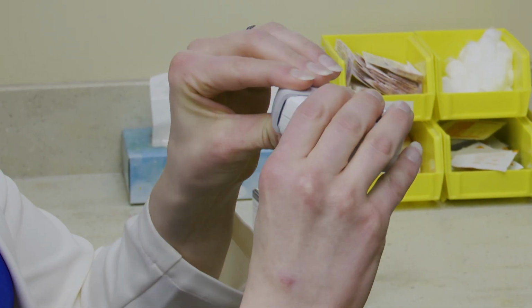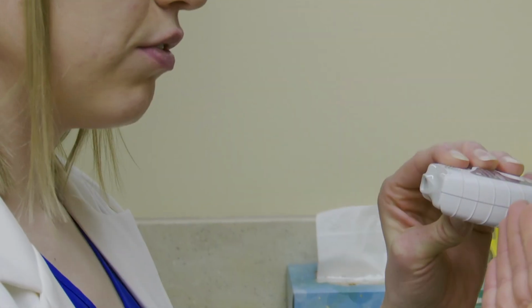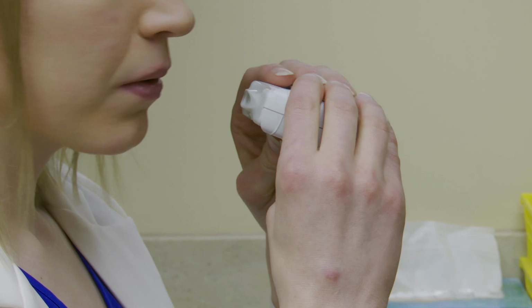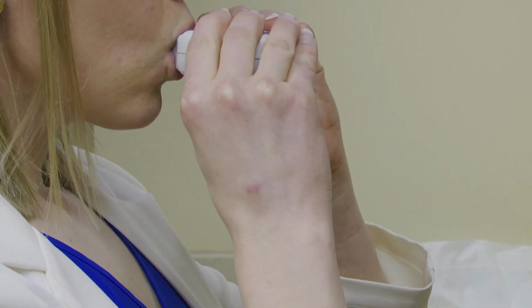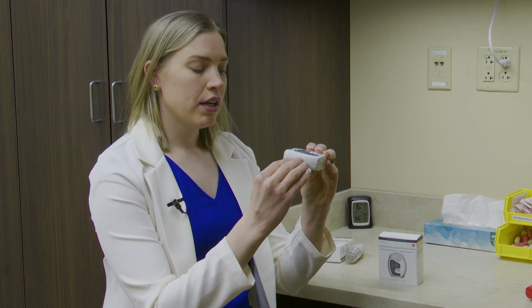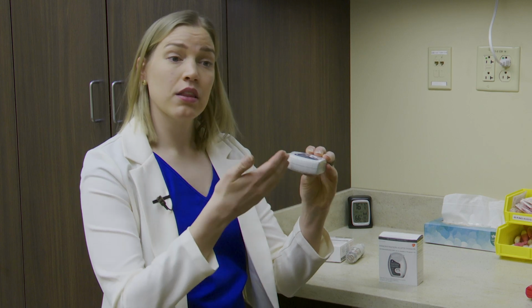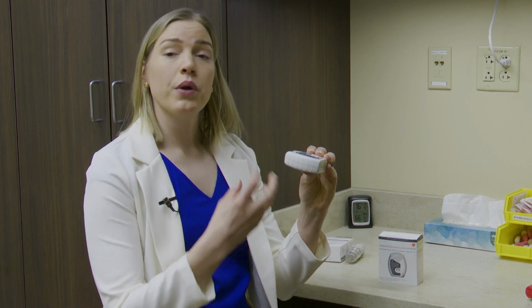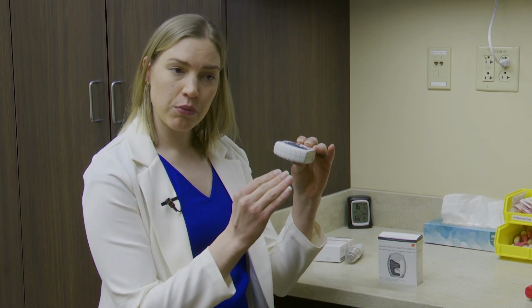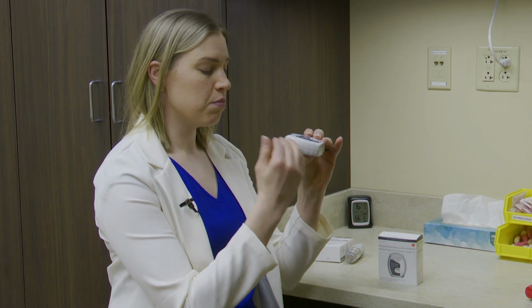For a dry powder inhaler, do not shake it, sit up straight, and lift your chin up for easy access to the lungs. Hold the inhaler like a hamburger, open the dose, and then bite around the opening. A dry powder inhaler doesn't have a propellant in it, so it is up to me as the patient with my inspiration to bring the medication into my lungs. So it is a quick breath in with this one. I'm going to breathe out around it because I don't want to breathe into my inhaler, and then I'll quickly breathe in.